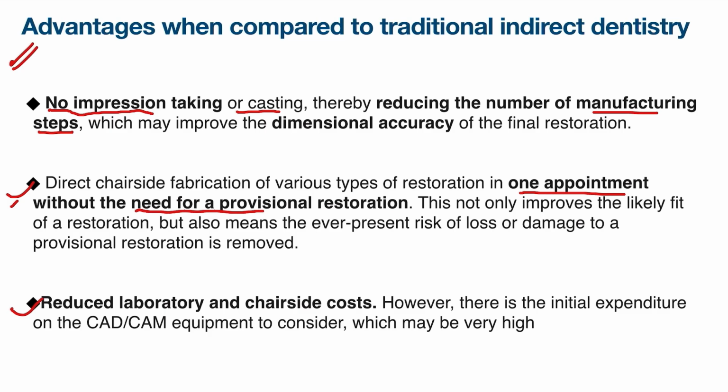So, like any technology, intraoral digital scanning is not without its challenges. Issues can arise at various stages of prosthesis fabrication. That's why it is crucial for specialists, especially prosthodontists, to have a deep understanding of the process. Proper knowledge helps prevent problems caused by inadequate scanning and equips you to find solutions when issues arise. So if you are planning to use digital scanning, make sure you fully understand the technology and address any uncertainties. This way you can achieve the best possible results and make the most of this powerful tool.